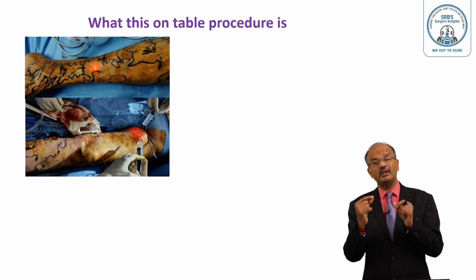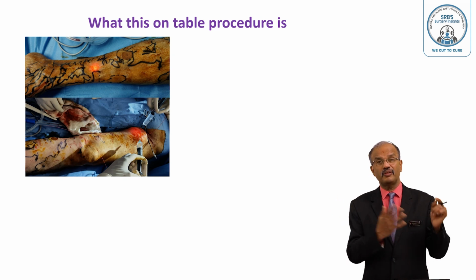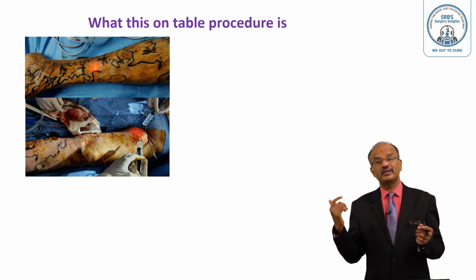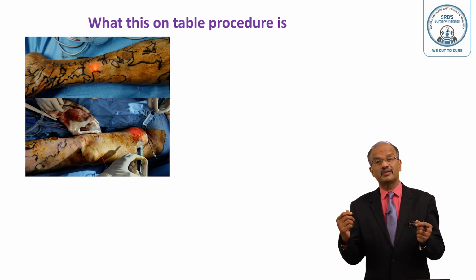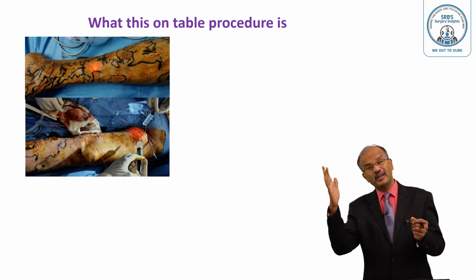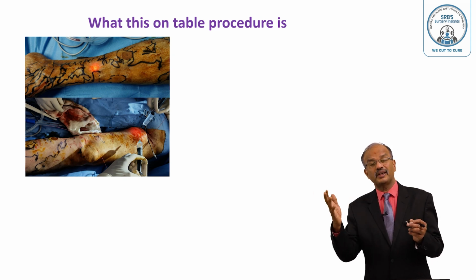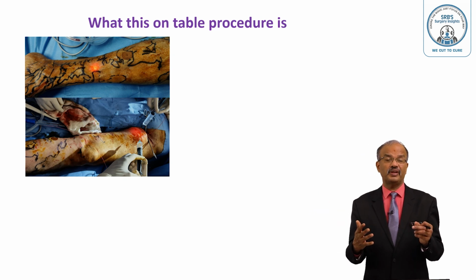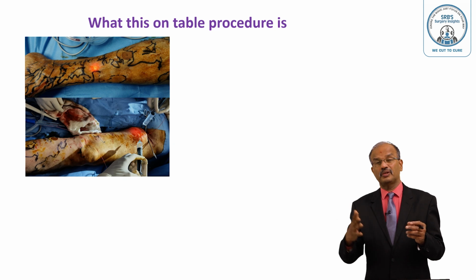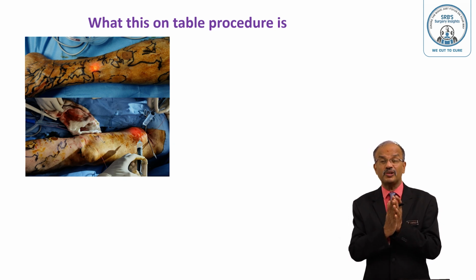Every 3 millimeters, you fire for 3 seconds at each point. The vein is cannulated and slowly withdrawn, every 3 millimeters for 3 seconds. So joules will come. In the leg, we use 8 joules per second, and go higher, 9, 10, 11, near the thigh. Like that we use the joule numbers, and because of that there is complete sclerosis of the vein.